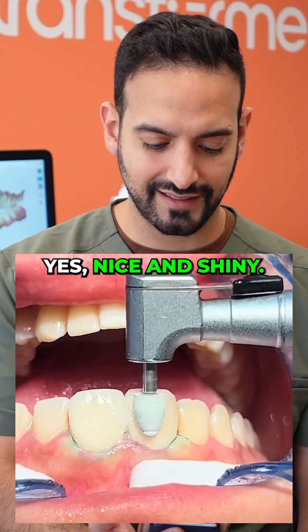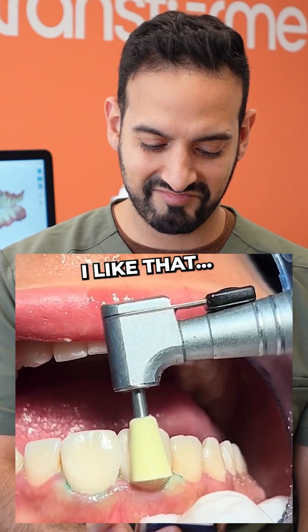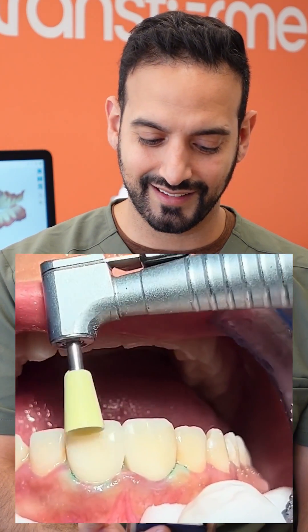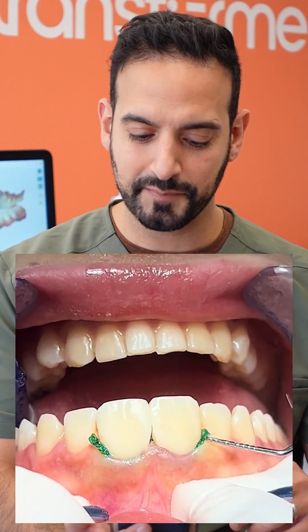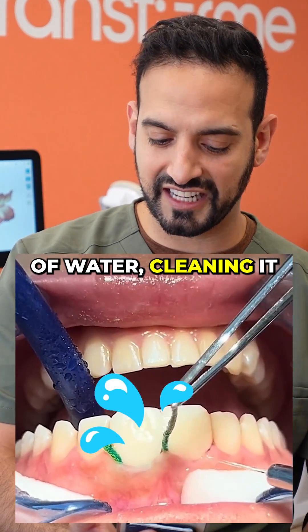Cleaning it up, polishing the teeth — yes, nice and shiny. A little more polishing. Taking out that retraction cord, a little bit of water, just cleaning it all up.